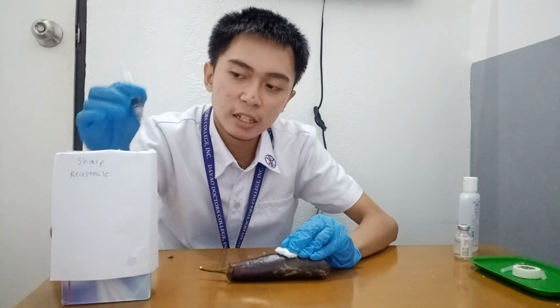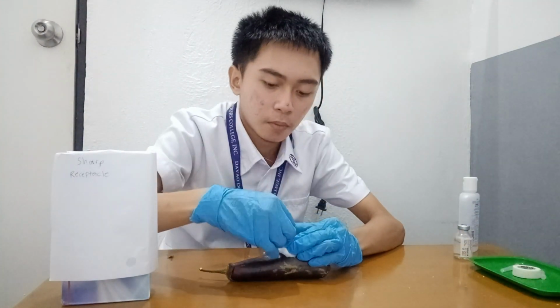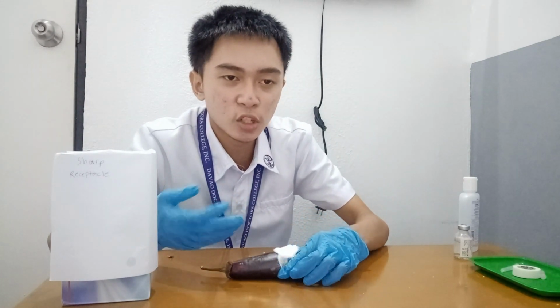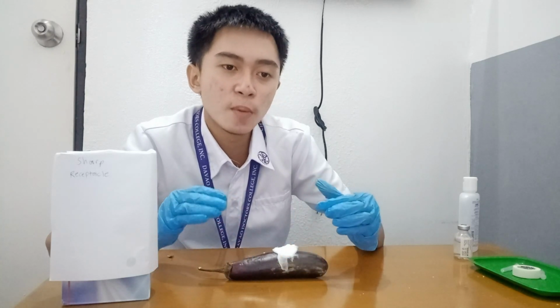And withdraw the needle. And activate the needle safety device or discard the uncapped needle and attach the syringe to the proper receptacle. And remove and discard gloves and perform hand hygiene.